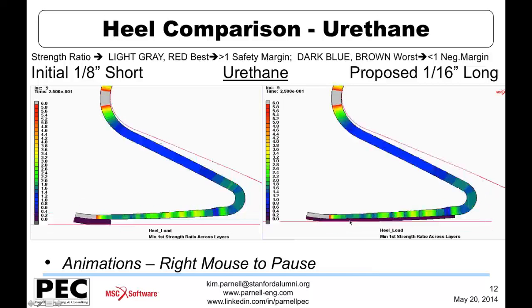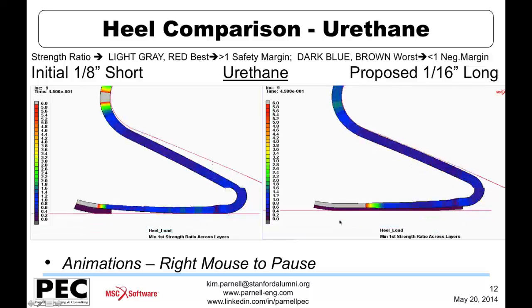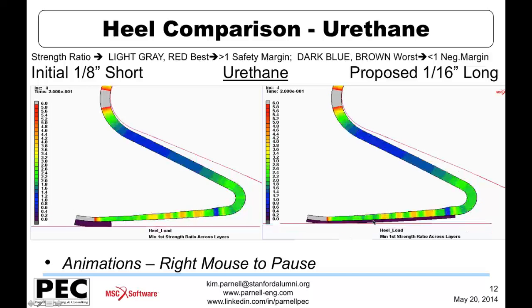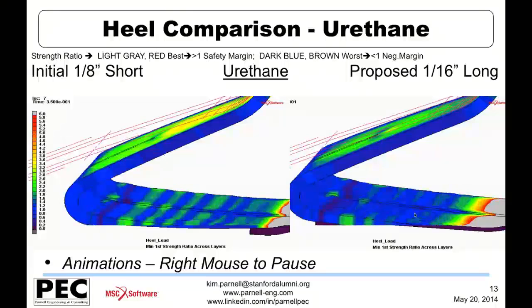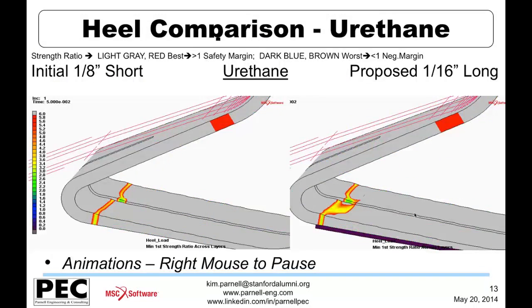And here on the right, there is a more progressive contact effect, and the effective or equivalent load gets moving closer and closer to the bends as it goes through. Here is another comparison just from a different view.